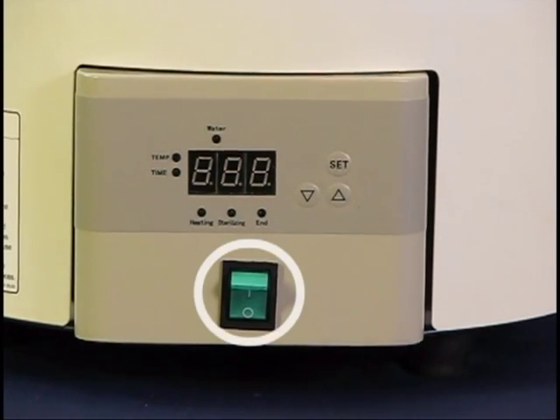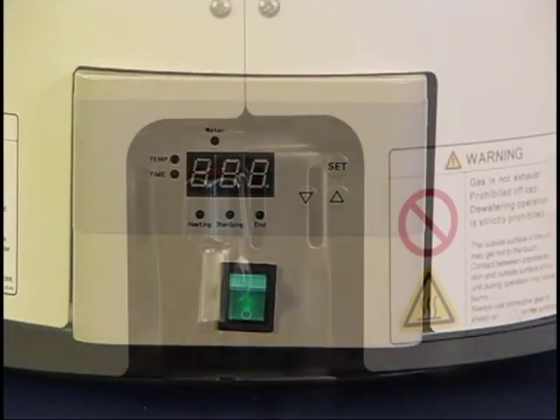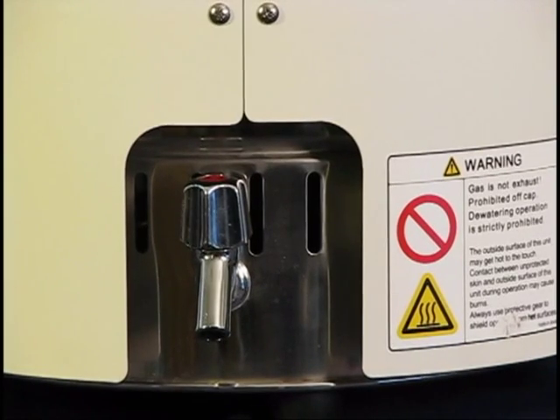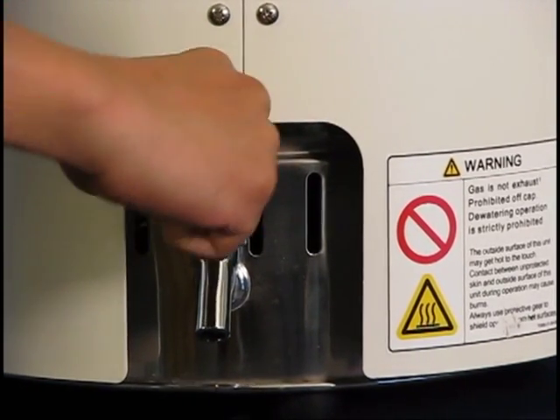When power is first applied to the unit, the power switch will illuminate even in the off position. Before operating the SK, make sure that the drain valve is completely closed by turning it clockwise.